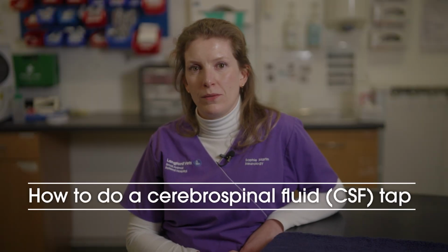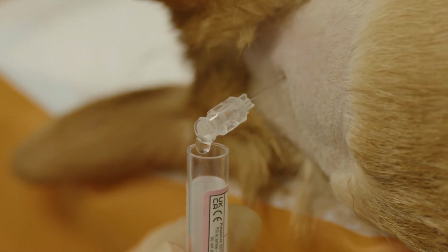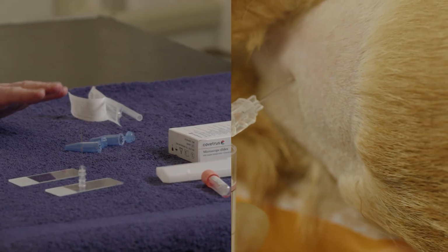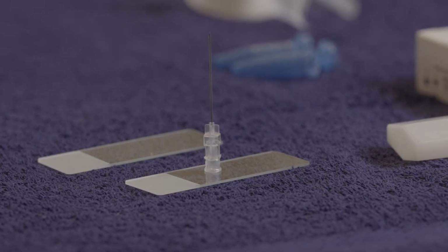Today we're going to talk about cerebrospinal fluid. Firstly, why we take cerebrospinal fluid. Secondly, the practicalities of how we take the sample. And then lastly, we can talk about sample interpretation and how we then handle the sample that we've obtained.